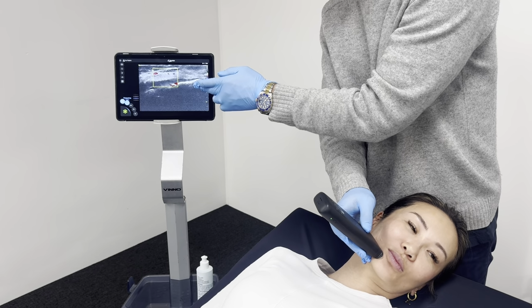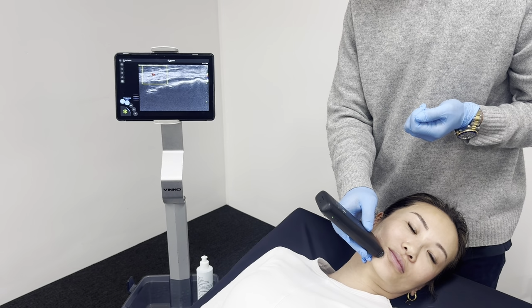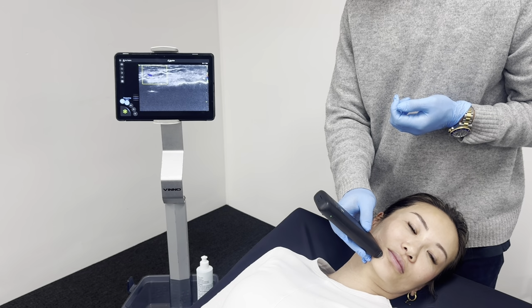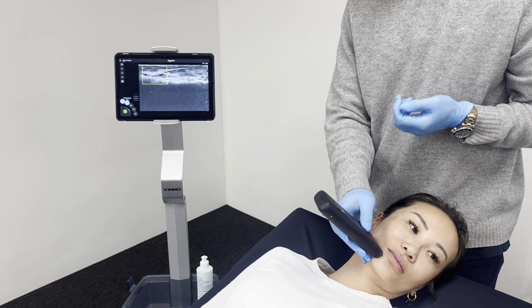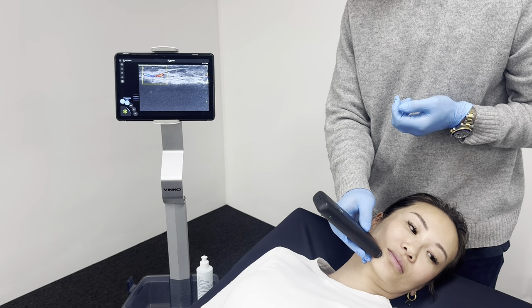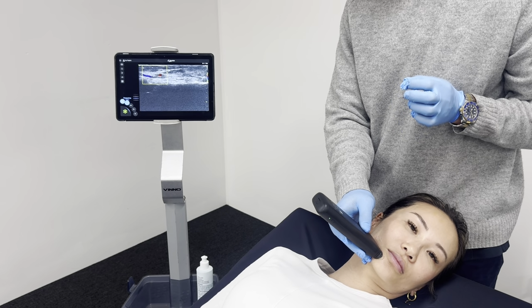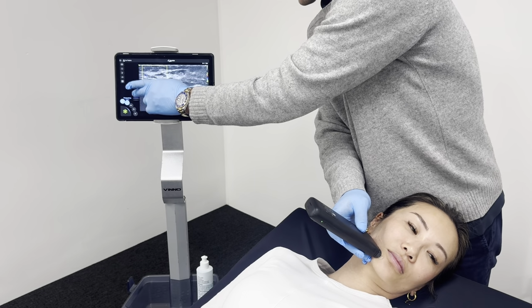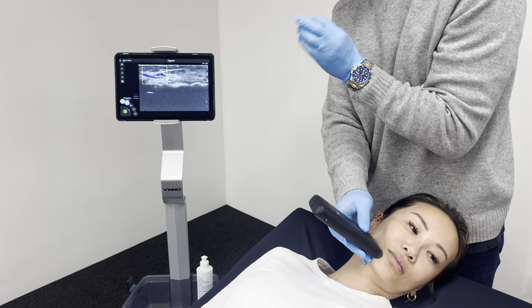So anything that's causing movement is going to show up in the colour box. So the red and blue means either flow towards or flow away from the probe. Red is usually towards the probe, and blue is usually away from the probe. So right now we're just over the facial artery, and you can see the same vessel has blue and red because some parts of it are moving towards the probe and some parts are moving away from the probe. For the face, ideally, you want to put your colour frequency, which again you can just adjust here, up to 6.3. See how that just made the signal a little bit more strong.